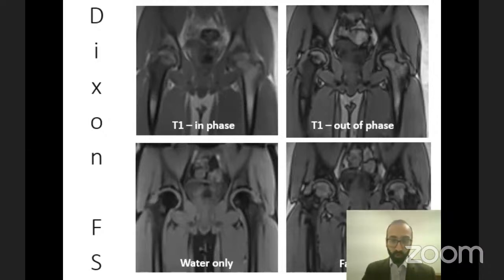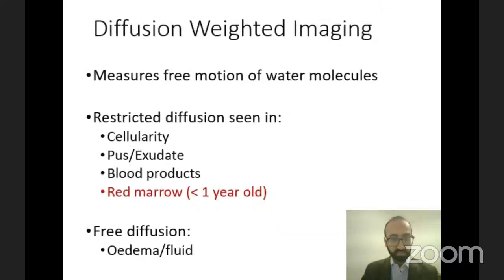And again, if you've got lesions in the marrow, for example, the femoral head has nice normal fat, so it's nice and bright, but there's a lesion that's quite dark in the right proximal femoral neck. Unfortunately, you've got red marrow on the other side, so the difference is not so stark. But this patient's actually got a little lesion in their femoral neck, which turned out to be metastasis.